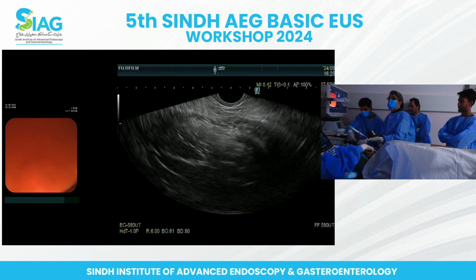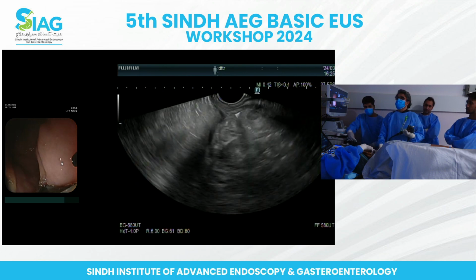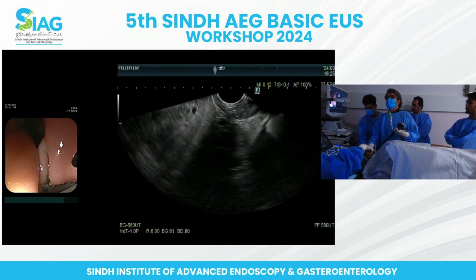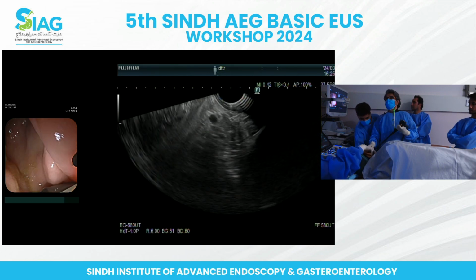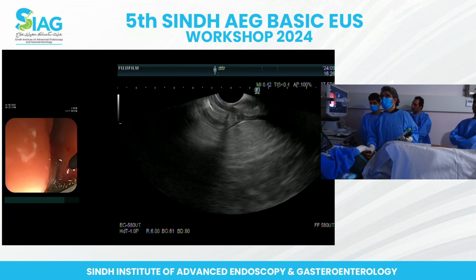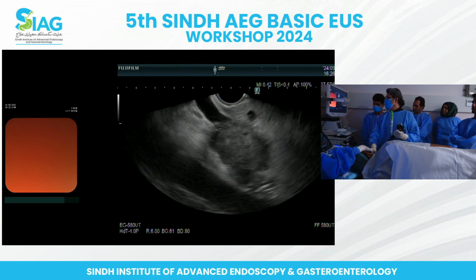I think at this point we are back in the neutral. You guys can see that these uncinate process masses could be challenging, even though the mass is quite big. If you try to do it from D2, sometimes the ducts come in the way as well. So that's the challenge he's having. He's trying to avoid those ducts if possible.